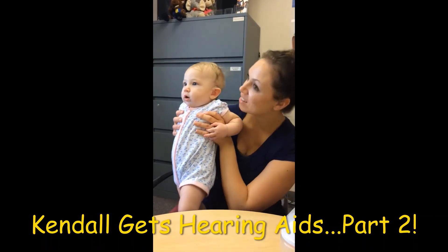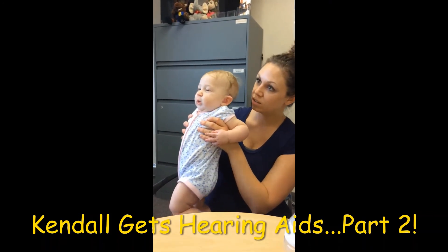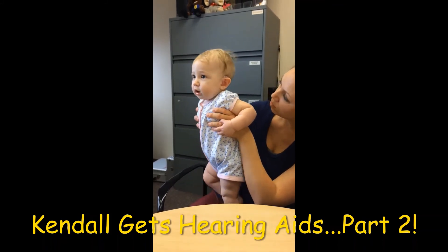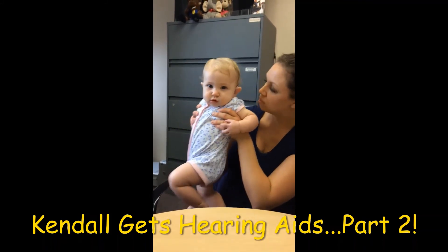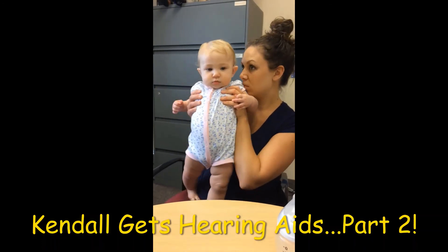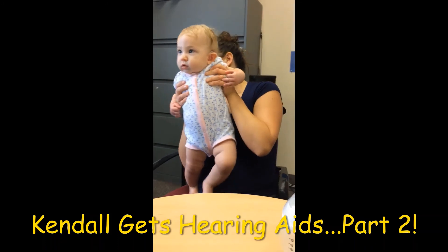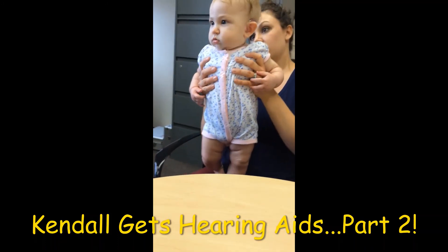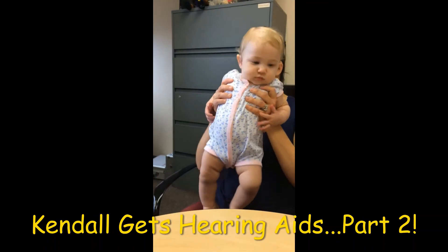Now, I want you to call me if you have any questions — like if you're not sure about this. Any questions at all. I don't anticipate any problems, but if you have any concerns, I'd like to hear that. Don't wait until your two-week follow-up and say you didn't have her wearing the hearing aids. Call me, I'll work you in. We'll deal with it. She needs to start hearing. She can do it in the car seat — it's fine.